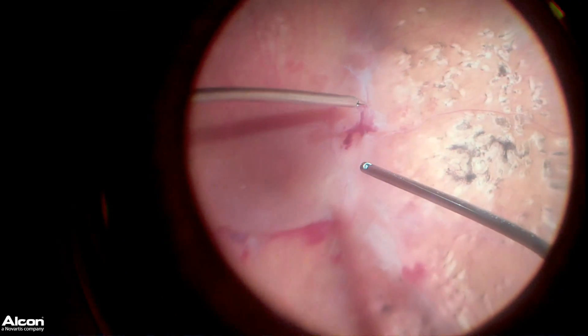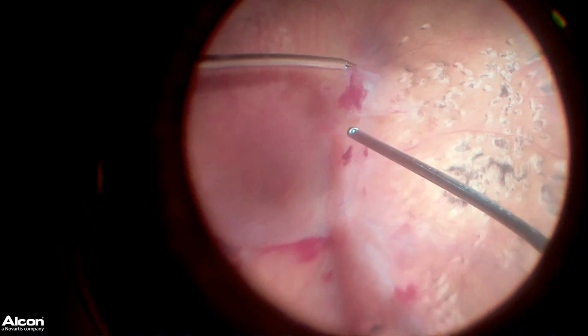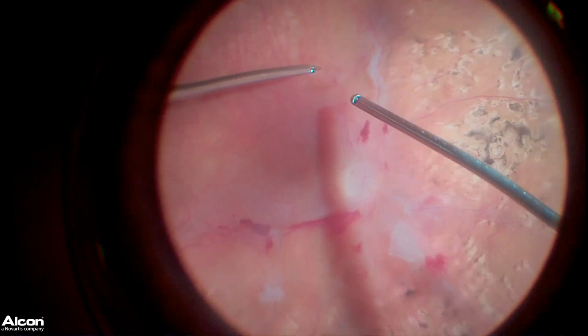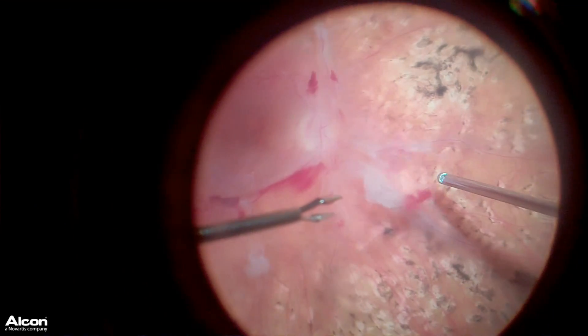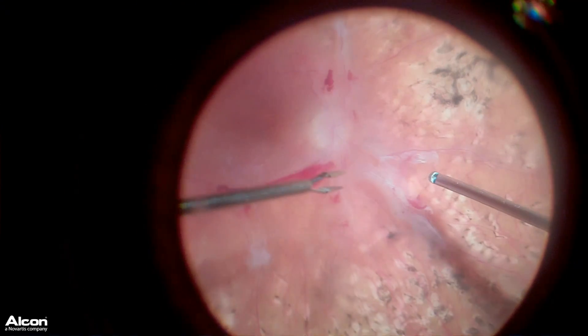I'm using my vitrectomy probe or cutter to help remove the scar tissue. Being able to manipulate and lift that scar tissue up, hold the retina back with my left hand, and see in areas that I normally couldn't see in, really allows me to perform surgery at a higher level than what I have previously.